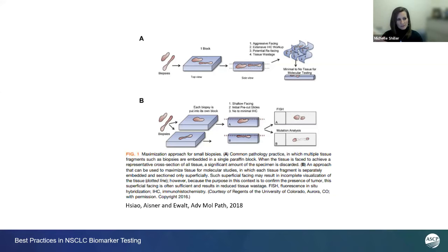So when you put the specimens in separate blocks, like you see in the B portion of the diagram, you see how you can optimize each tissue fragment for its individual change in shape and size. And even if all the tumor is in block B, you would know how careful to be. But in the perfect world, we'd have tumor in both sections and we could really spread out the tissue, not only for diagnostic confirmation of what we're dealing with for that initial diagnosis, but also for the downstream testing.